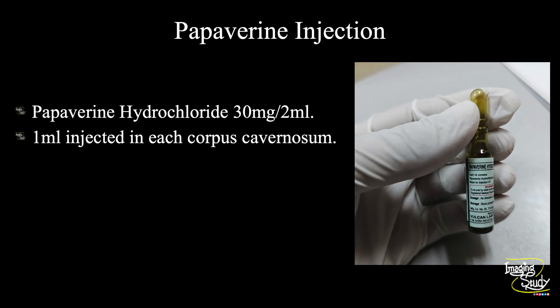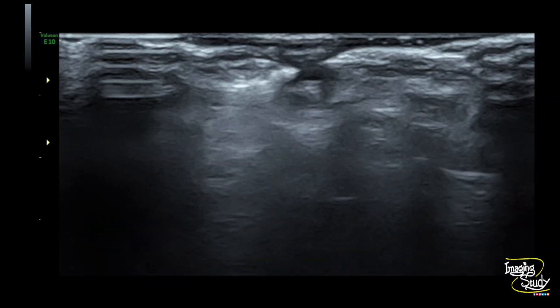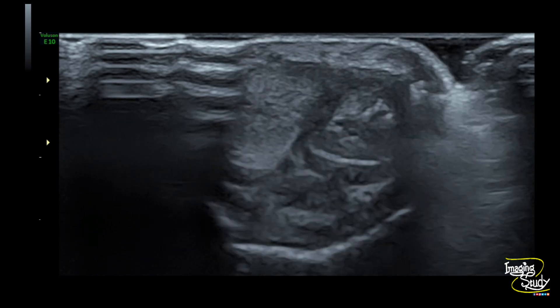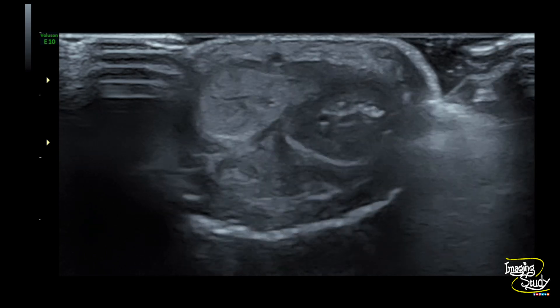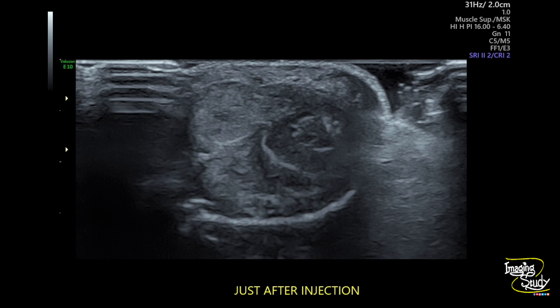Now we have used the papaverine injection. This is the ampoule we used — papaverine hydrochloride 30 mg per 2 ml. We injected 1 ml into each corpus cavernosum with an insulin syringe at the proximal parts. Here is the picture of the corpus cavernosa after the injection. You can see echogenic foci confirming the drug was injected at the proper site, which we also confirmed with ultrasound guidance during injection.